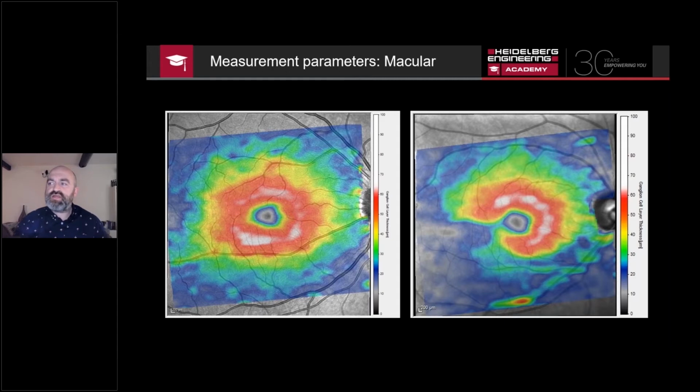Now on the right, you can actually see a damaged ganglion cell from glaucoma. And what's happened here is the damage to the nerve axon has actually taken a bite out of this structure. So here you can see a little piece missing. It is common to see a small indentation on the temporal side anyway, because that's, of course, the architecture of the retina and the temporal raphe of the retinal fibre layer. But it's very clear when you can see a piece missing from the ganglion cell sometimes with glaucoma.